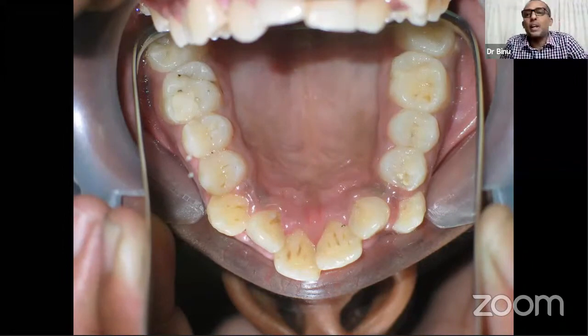The biggest mistake you can do is showing this picture to the patient. Don't show this picture to the patient. First and foremost thing in mobile photography, when you take a lot of pictures, do not show to the patient like this immediately. That's not professional. First of all, you do 3 swipes. The fourth one can be some WhatsApp picture that got downloaded. You can be totally embarrassed. Don't do that. If you're using mobile in your clinic, put an airplane mode. Because while taking picture, you get a WhatsApp, you look at it, you smile for some time, and then again keep taking picture.